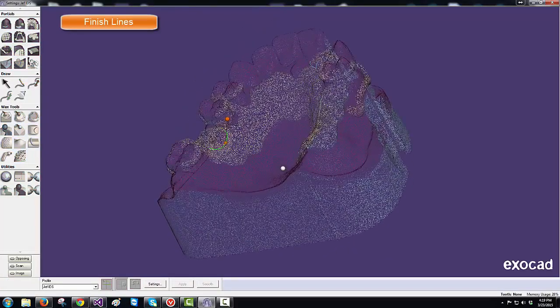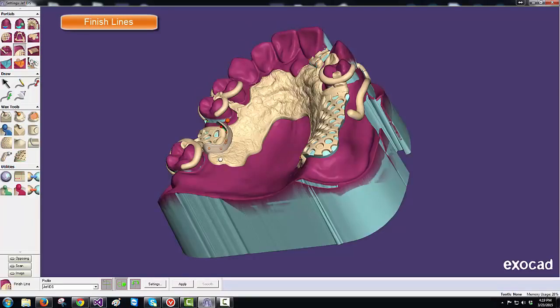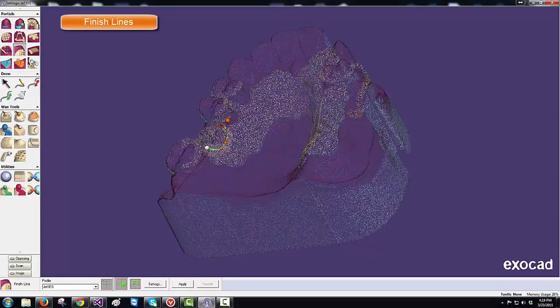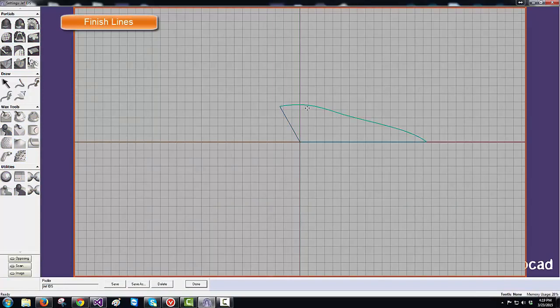We have a profile library that brings up a default. You can see here in the library a list of some other ones available. And you can also create your own profile here with this icon. And you grab the points, create a pattern, and then we want to save that as whatever you name it, and then press done.